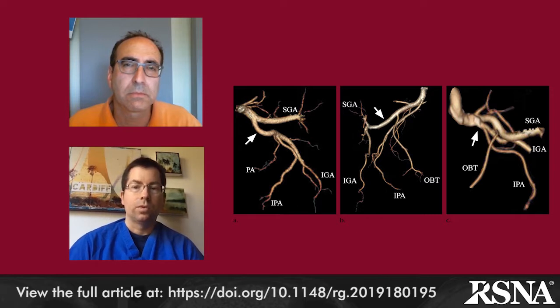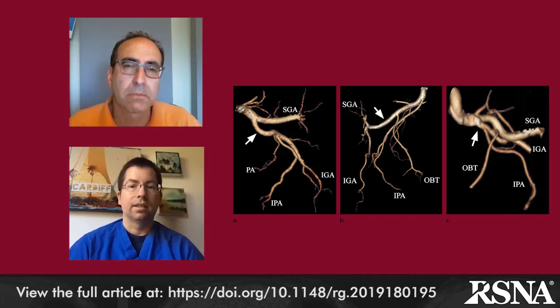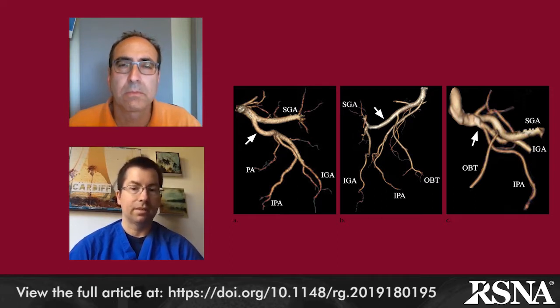It's not important to really memorize all the different classifications and schemes, but it's important to identify the major branches in each case. So the superior gluteal artery, for example, is often the larger branch, exiting the greater sciatic foramen and supplying the musculature. And the inferior gluteal artery exits the inferior aspect of the sciatic foramen, again terminating in muscular branches, while the internal pudendal artery, seen adjacent to the inferior gluteal artery in the sciatic foramen, has a characteristic 90-degree curvature. So recognizing these patterns helps you identify these arteries, both on the pre-procedure imaging and during the procedure itself.